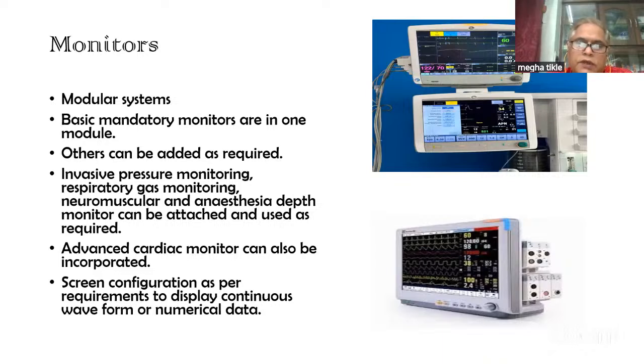Screen can be configured to around 8 waveforms and as many figures. So you can choose what you want to see in waves and you can choose what you want to see as numerical data that is to be displayed on the screen.